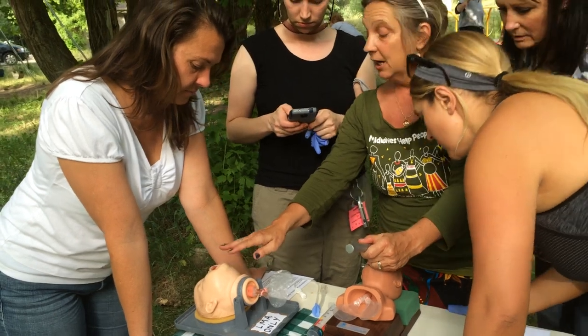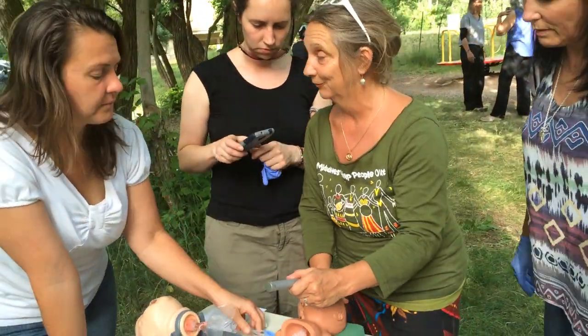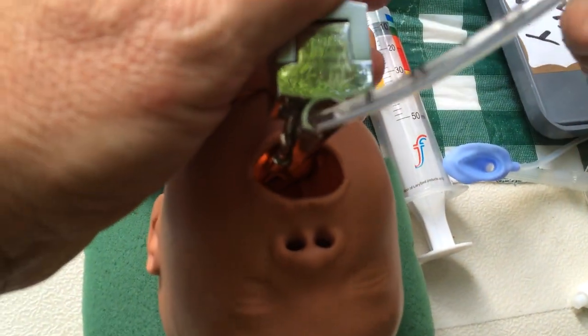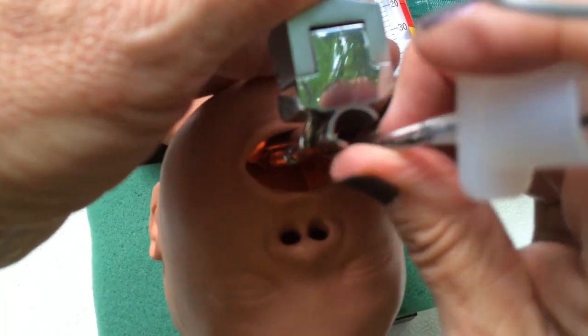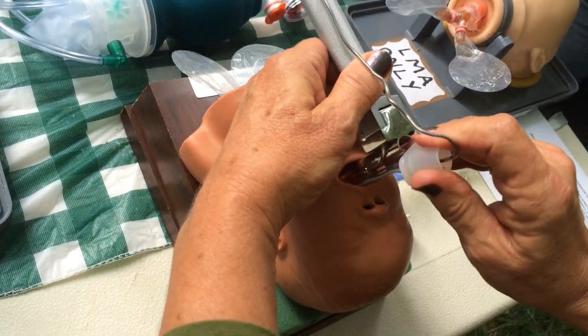On these two babies, you cannot see the vocal cords. So this is an alternative to this? Correct. If you were going to do this, I need to look one more time. You would hold this like this, and then you would insert the ET tube in between the vocal cords. There we go. So that's in there.